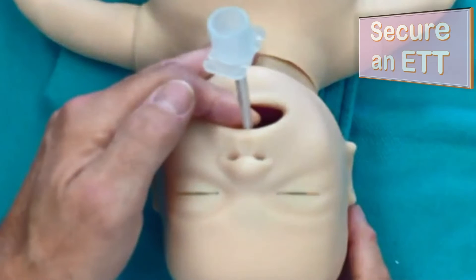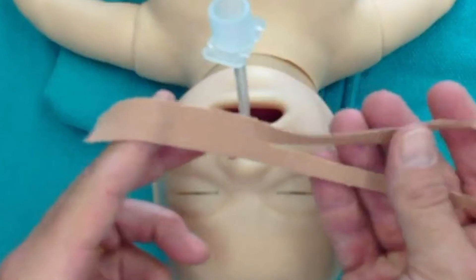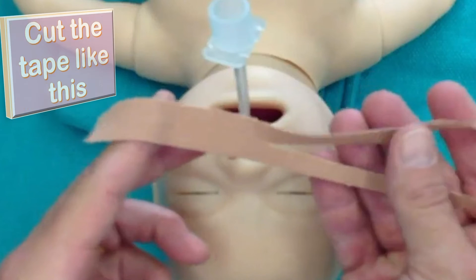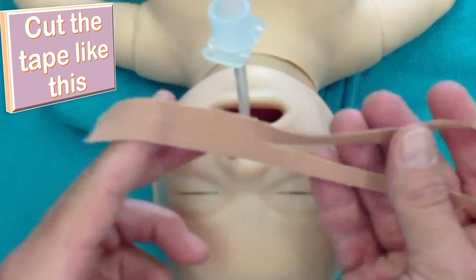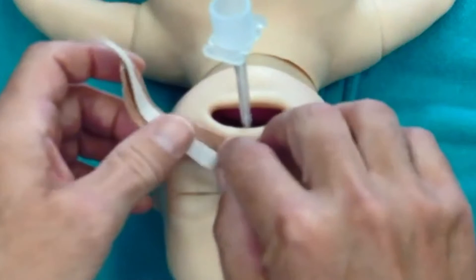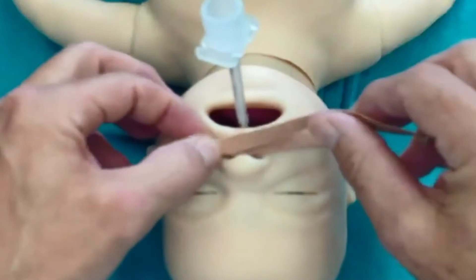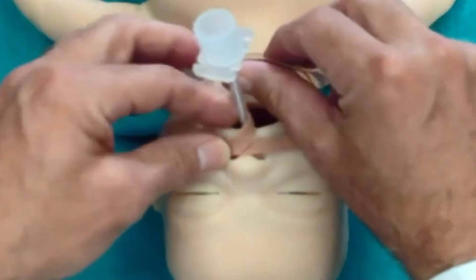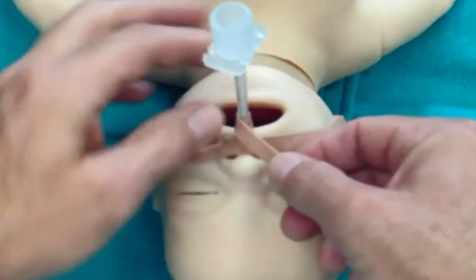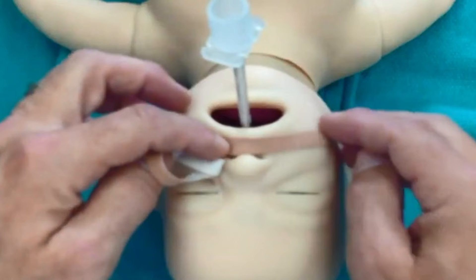Once the endotracheal tube is in position, the next very important step is to secure it appropriately. Get the tape and cut it so that the ends reach from one ear to another on the neonatal face, cut vertically halfway. One cut end of the tape should lie just beneath the nose as you can see here. Take the other cut end of the tape around the endotracheal tube to secure it completely. Be careful not to put too much tension on the tape because it can pull the ETT out of the trachea — be careful and be gentle.